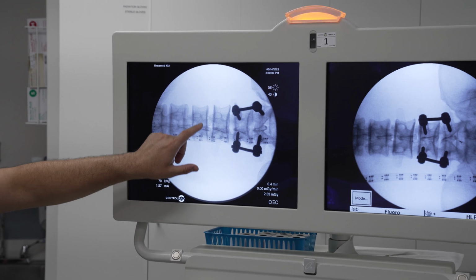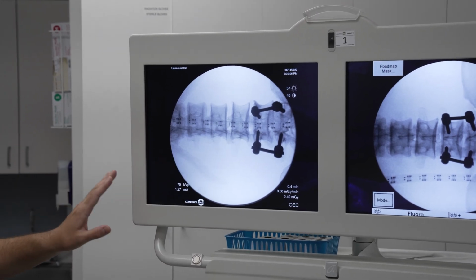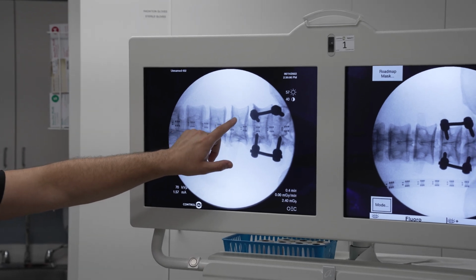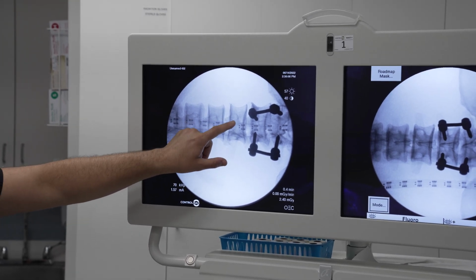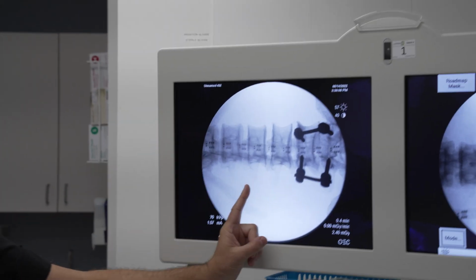Keep going a little bit more. And this is our classic Scotty dog. Keep going a little bit more. Perfect. So it's easy to see the Scotty dog here. Here's the eye of the Scotty dog, the mouth, the ear, 1 foot, another foot right there, and the tail here. And the Scotty dog's looking that way.